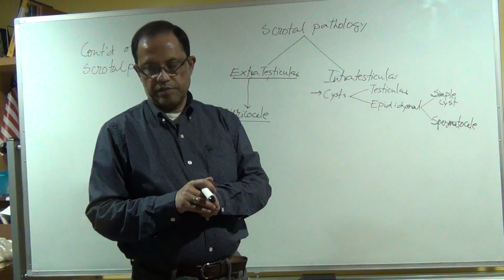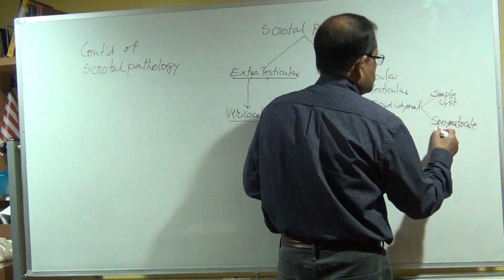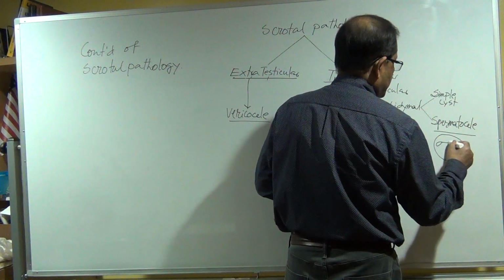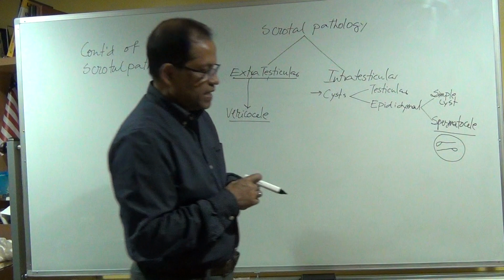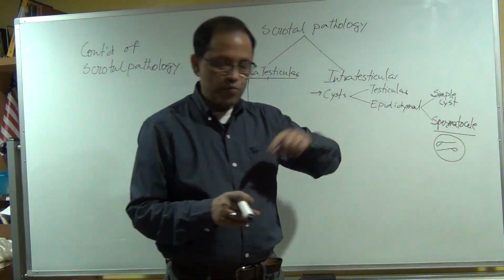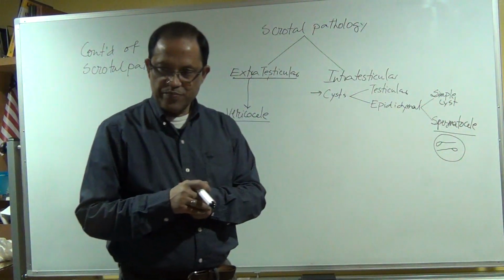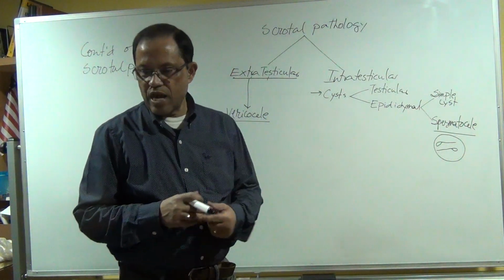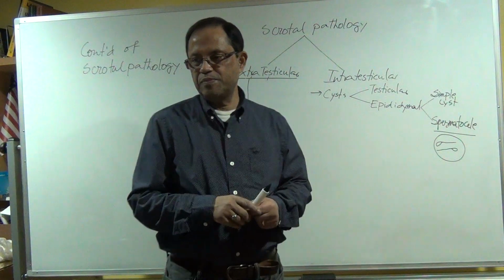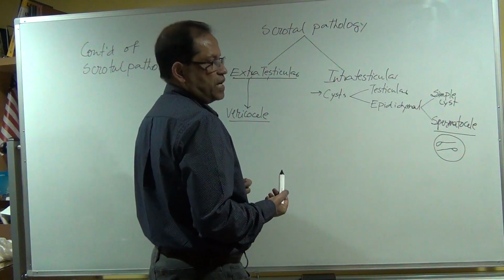Sonographically, we cannot differentiate, but with high resolution, we can see in spermatocele something is moving, because this cyst is formed by the spermatic fluid, and that spermatic fluid has a sperm. You can see it's moving. In that way you can differentiate. Otherwise, they will aspirate the fluid and under microscope they will see the sperm. And all those cysts look like a simple cyst, and they maintain all four criteria of the simple cyst.